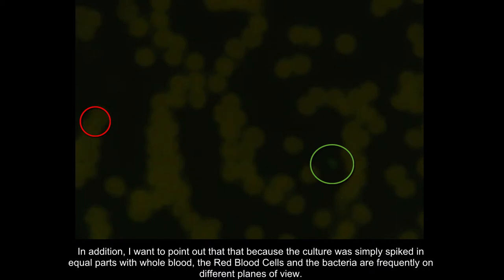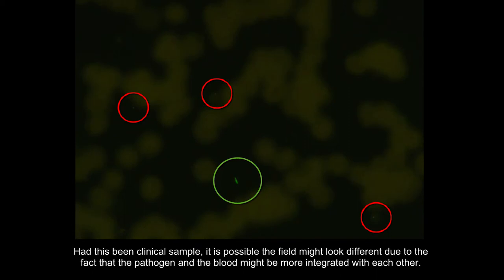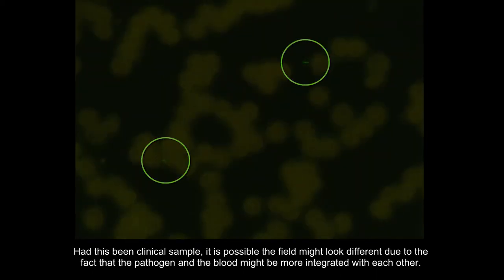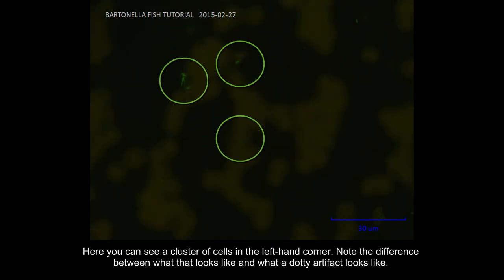In addition, I want to point out that because the culture was simply spiked in equal parts of whole blood, the red blood cells and the bacteria are frequently on different planes of view. This is why the bacteria are usually in focus when the RBCs are not. It is therefore essential to be constantly fine focusing in and out across each field to make sure that all the layers are checked. Had this been a clinical sample, it is possible that the field might look different due to the fact that the pathogen and the blood might be more integrated with each other.